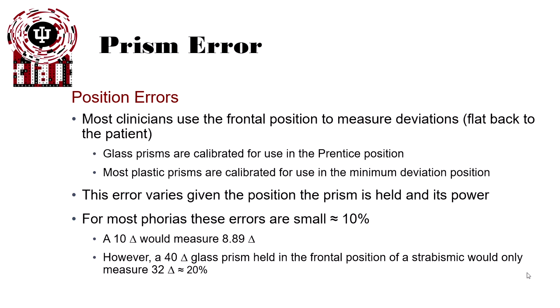However, it's important to keep this in mind. Glass prisms are calibrated for use in Prentice's position, and most plastic prisms, like the ones we have in our clinic, are calibrated for use in the minimum deviation position. This error varies given the position of the prism in which it's held, and its power.